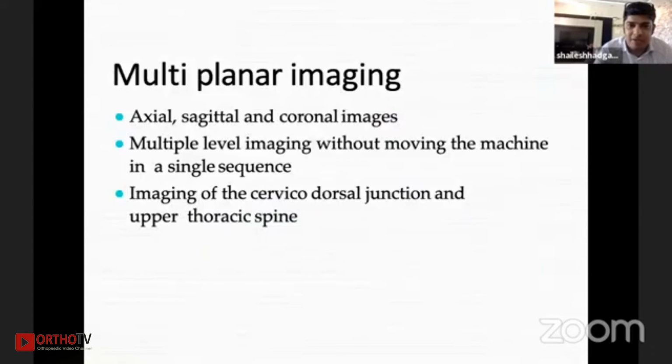I think this is definitely going to be a game changer in future, and for safety of the patient, this is a very useful tool. And we are learning with this. Now we are talking about it because we have done a lot of cases in recent time. It's multiplanar, it's 360 degrees imaging. We can exactly see what you really want. And I think this is going to be there as we used to use C-arm in future. I'm sure they must be working a lot on orthopedic applications of this, and in the near future we'll see a big sea change in all the surgeries.